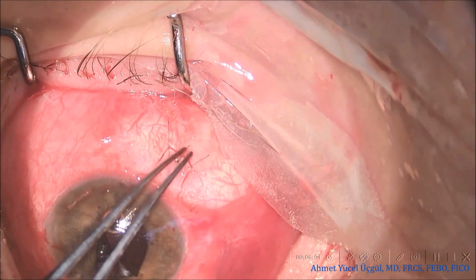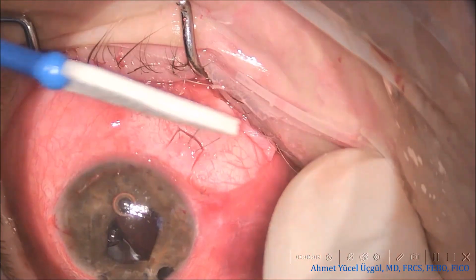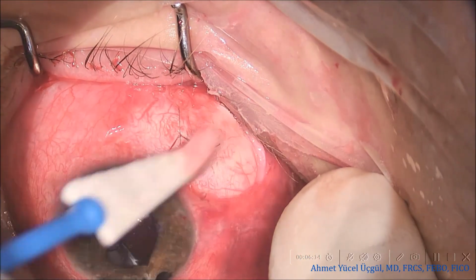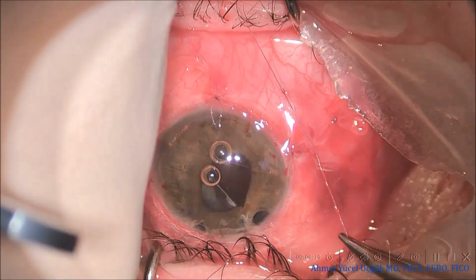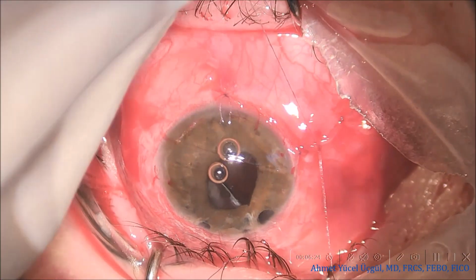After burying the nylon sutures, we can see that the thin tube remains completely covered beneath the sclera. As in the previous case, the conjunctiva and Tenon's capsule are then closed over the implant. Keeping the tube entirely intrascleral provides additional protection against tube erosion, peritubular leakage, and postoperative infection.